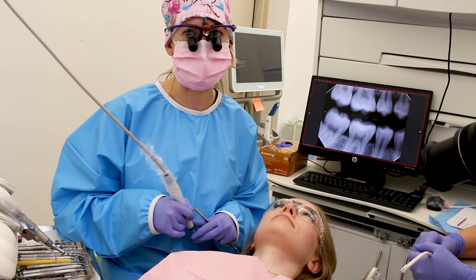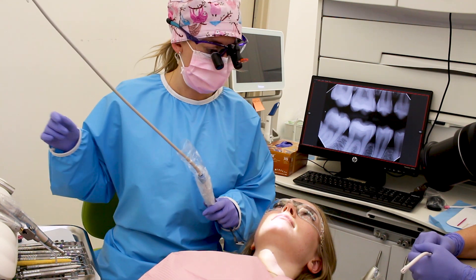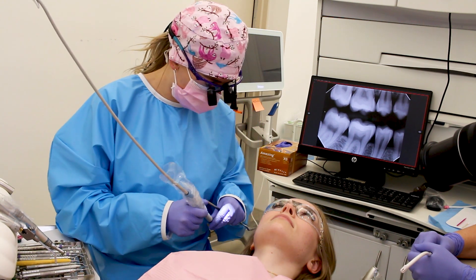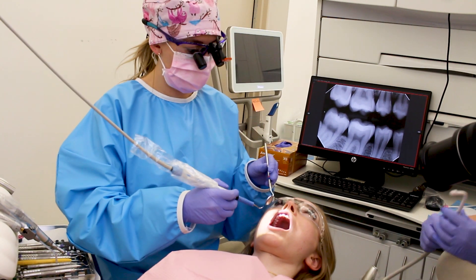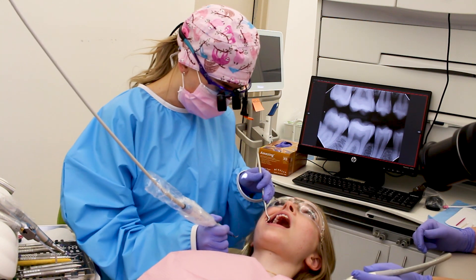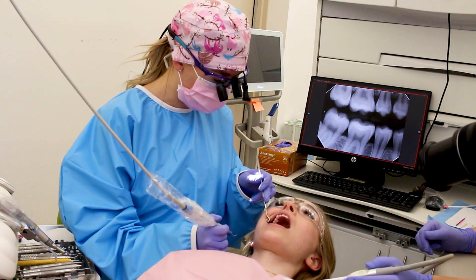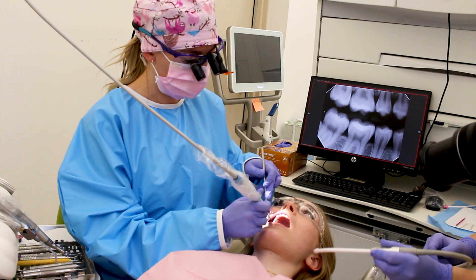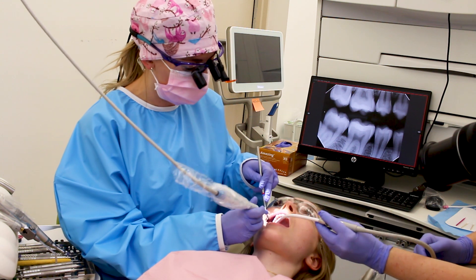It also sprays a lot of water, so it's cooling and makes you less sensitive when getting it done. We're going to turn this down a little bit because you don't have a ton of calculus. Let me know if it's tender or painful — a couple spots where your gums are bleeding might be a little more tender because they're inflamed. If it's too much just raise your hand or let me know if you need a break.